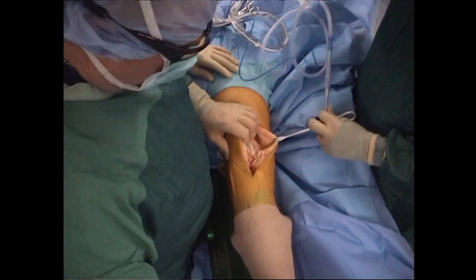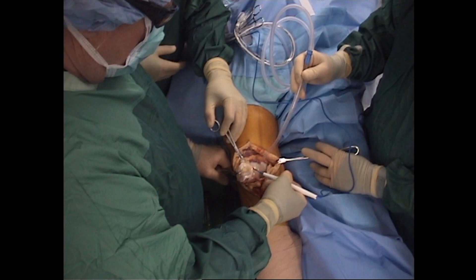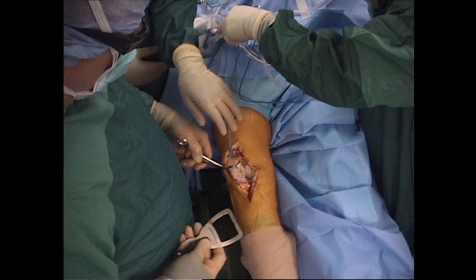The knee is extended and the patellar clamp is used to evert the patella. The towel clamp is placed superiorly to aid in exposure. Bovee cautery is then used to perform an internal lateral release, feeling the pop of the lateral patellofemoral ligament as it's released. The medial sagittal ridge of the patella is then marked with the bovee and calipers are used to measure the thickness.